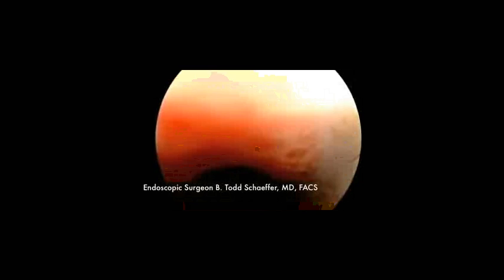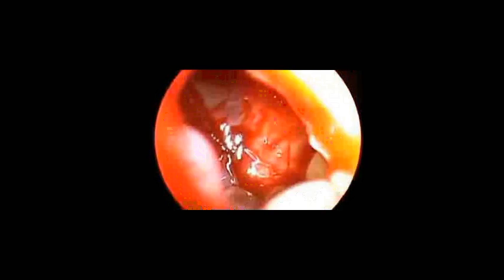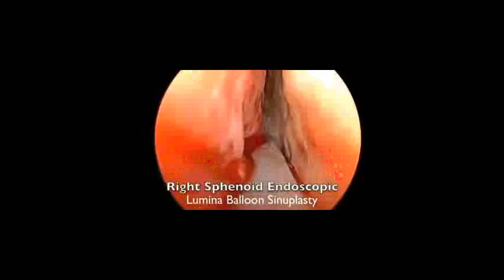At this point, a modest opening of the sphenoid ostium is made. Some polypoid material is seen around it. A second pass was elected to be performed, and at this point, an excellent opening in the sphenoid was created. Some polypoid material can be removed, but care must be taken in not injuring the artery, which is right below it.